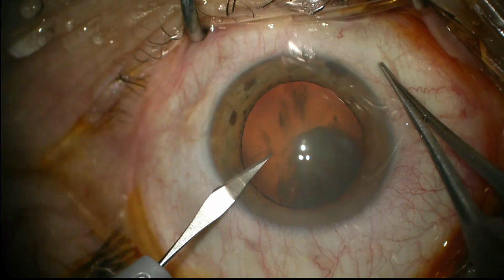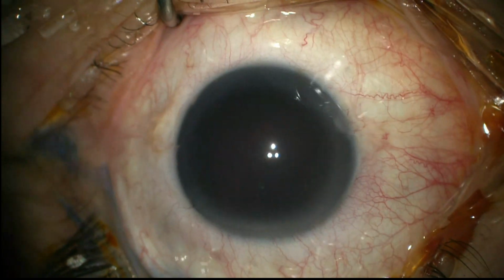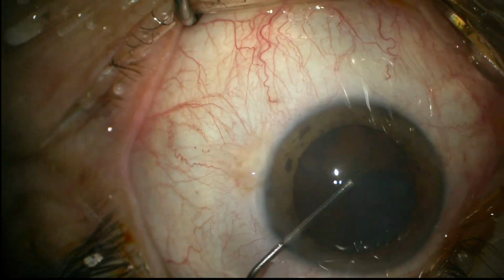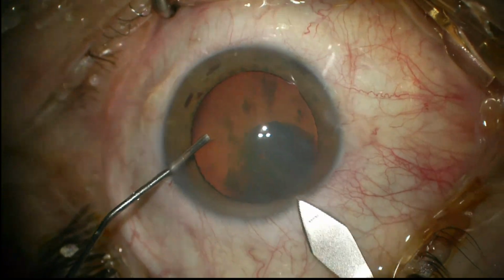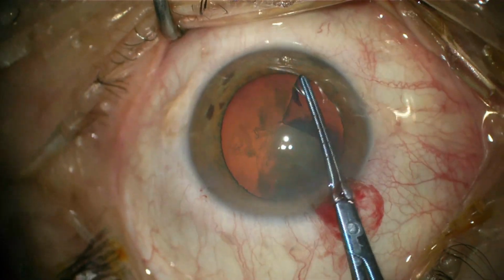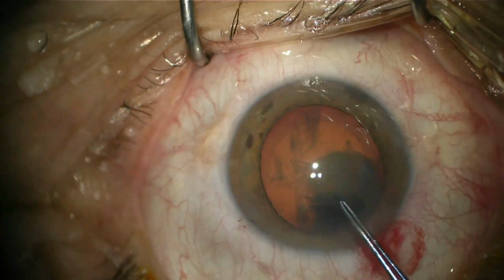Look how the pupil is well dilated and stable. The accessory incision is made and trypan blue enters the anterior chamber. Now viscoelastic goes into the AC and the main incision is made. Here comes the capsular rhexis. A 4 to 5 mm rhexis is ideal.